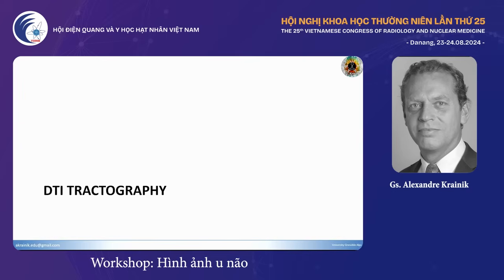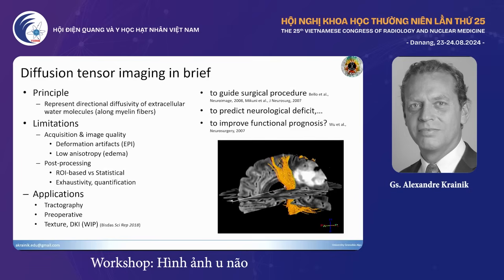Okay. Now we have to consider that perfusion and basic diffusion are not really advanced techniques, and spectroscopy shouldn't be anymore. But let's say, it's in this category where we still consider them. Well, tractography is quite a bit different, and let's say that it's rather more illustrative than anything else.